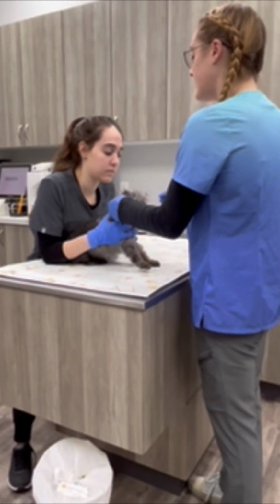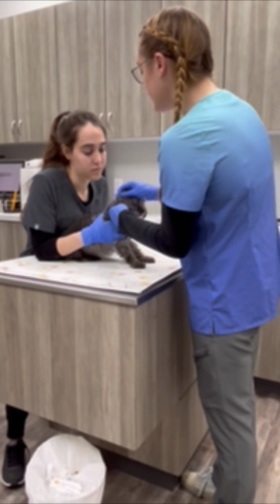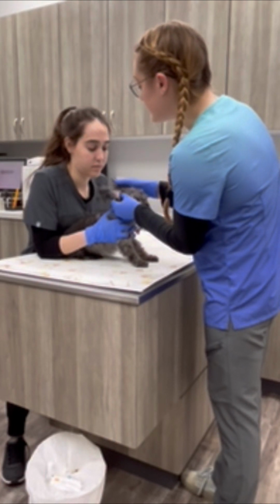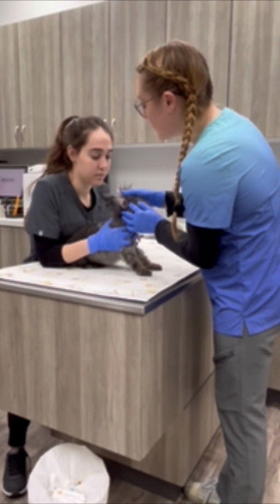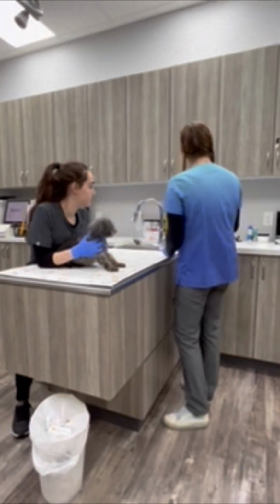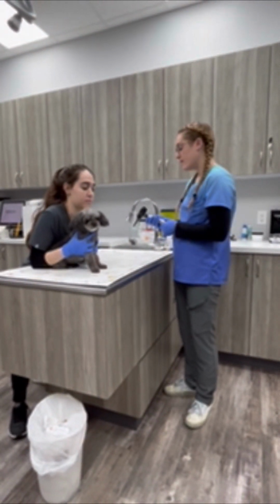Repeating on her right ear, again, there is no hair loss on the outside of her ear. On the pinna, that appears normal, no redness, discharge, inflammation, or any other abnormalities detected, along with her external ear canal. I will now be using the otoscope to visualize the tympanic membrane on my patient.